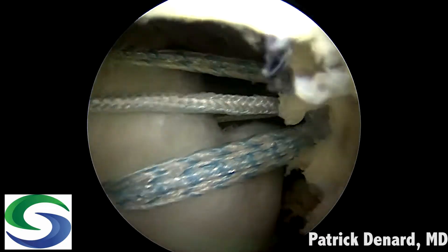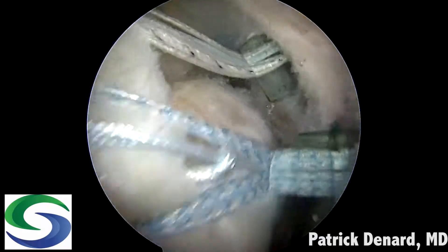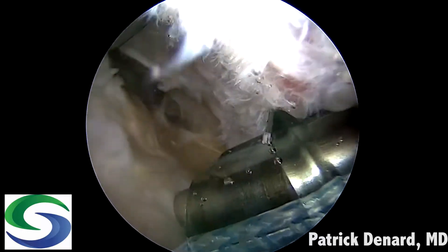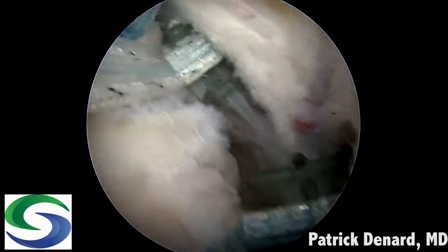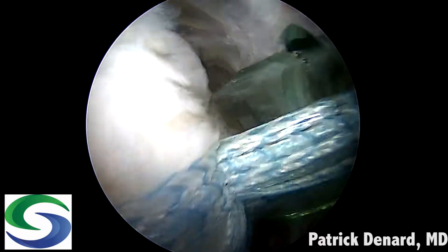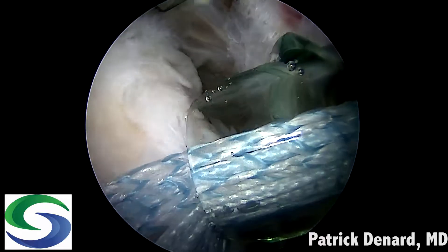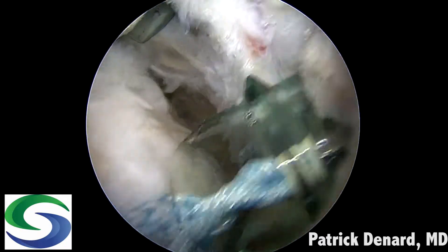Then we place a second inverted mattress suture and a fiber link medial to that to create our knotless ripstop. We then take these out laterally and complete our repair. We use the cannulas to guide the location for our bone socket. The bone socket is created and we can insert our 5-5 biocomposite swivel lock anchor. One step not shown here is we typically create bone vents in the tuberosity with a small punch to encourage biological healing.